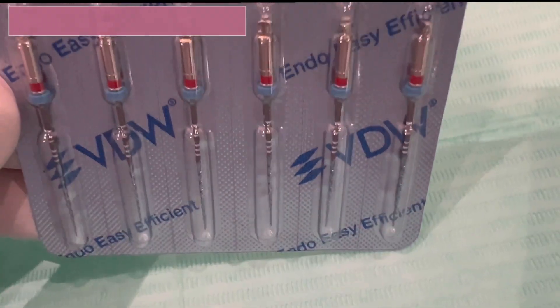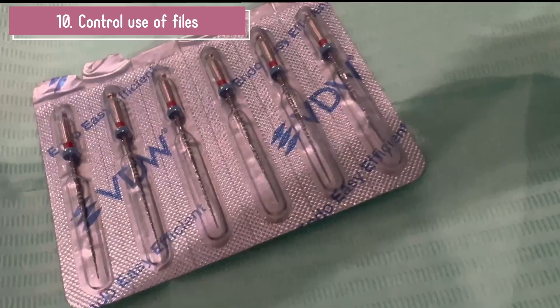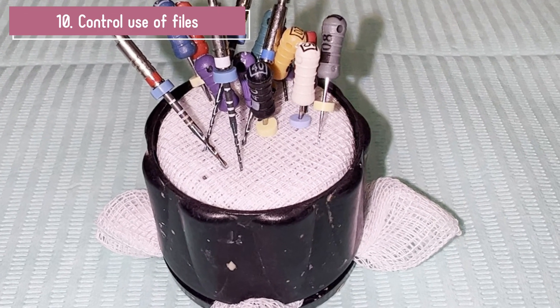The ideal is always to use new files. Sometimes it is not possible, so it is important to control the use we make in each case.